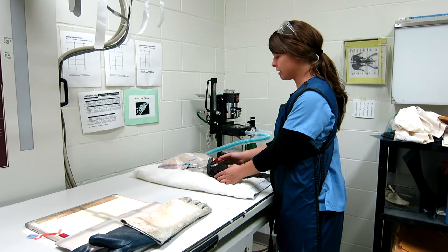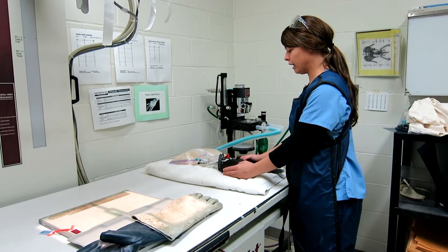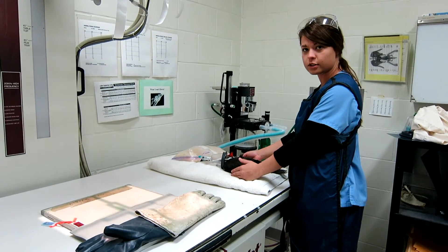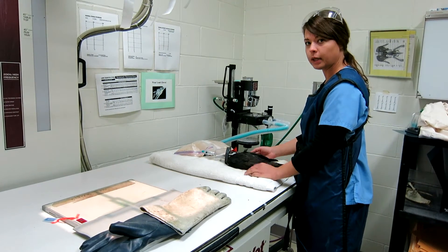I'm Jessica, and I'm a veterinary technician here at the Wildlife Rehabilitation Center. This is a pileated woodpecker, and it was transferred here from Wildwoods Rehabilitation Center in Duluth. Dr. Renee Schott requested some shoulder radiographs.